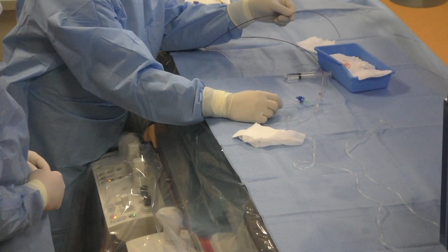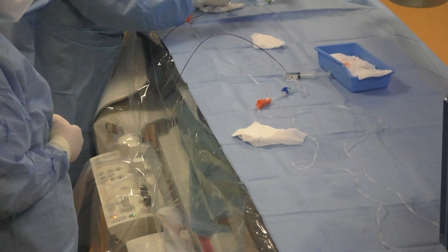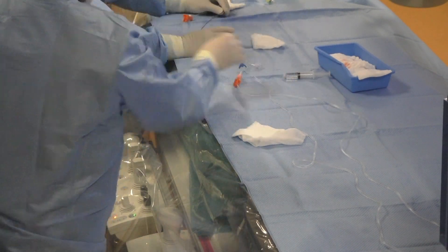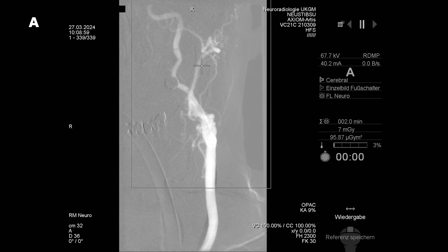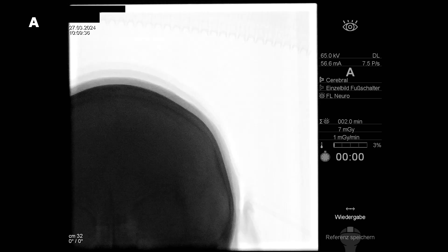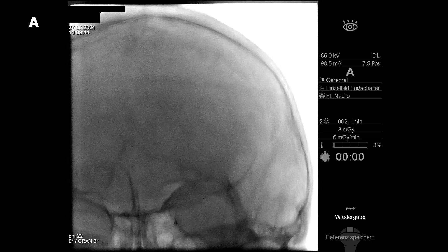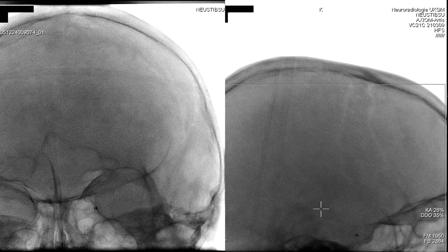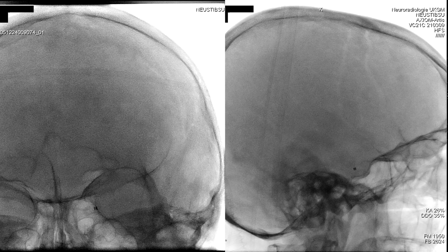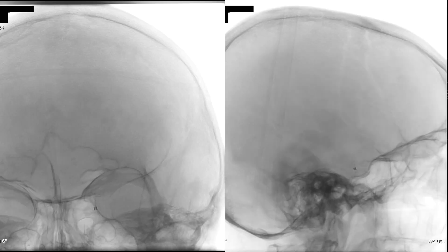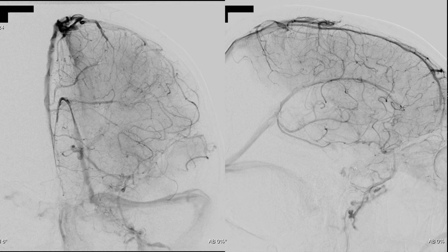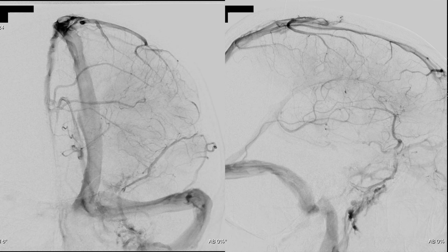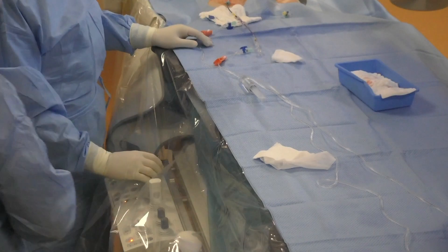We removed the Select catheter because we reached our first destination. Now we have the intermediate catheter Penumbra 5 Max, and we are inserting it and navigating the distal parts of the internal carotid artery. We've reached the petrous segment of the ICA. As you can see, we have a high-grade stenosis of the left middle cerebral artery in the M1 segment with a very delayed flow in almost the entire MCA territory.